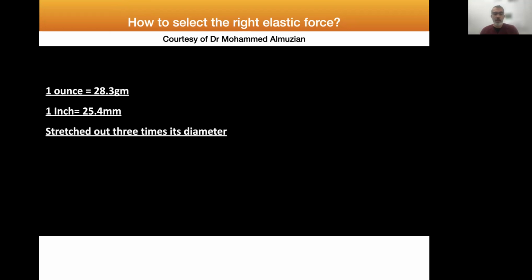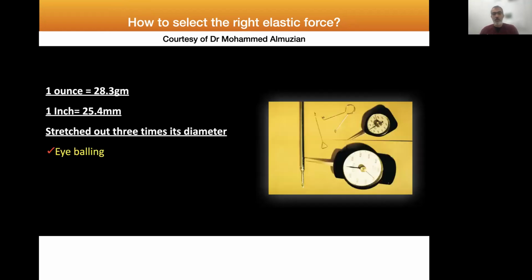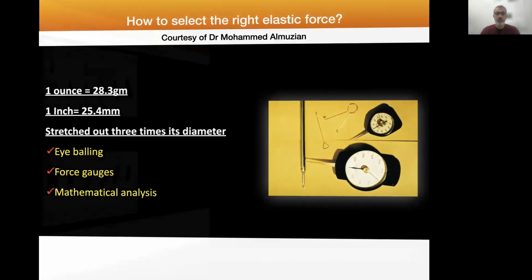With regard to the force written on the package of the elastic, that force will be delivered only when the elastic is stretched 3 times its diameter. So we need to stretch the elastic 3 times in order to achieve the force written on the pack. There are 3 ways to choose the right elastic. We can eyeball it, which mainly depends on the skill and experience of the clinician. You can use a force gauge, where ideally you determine how much force you need, or you can do the mathematical analysis, which is important for you to understand.